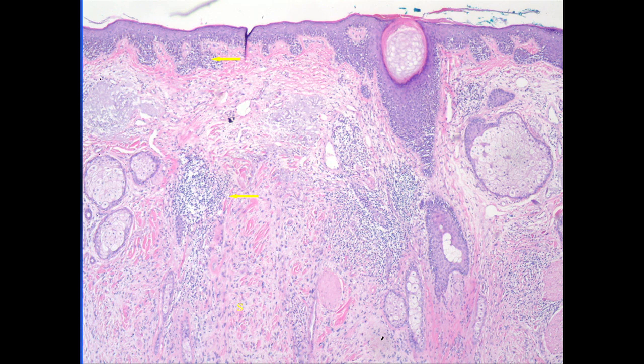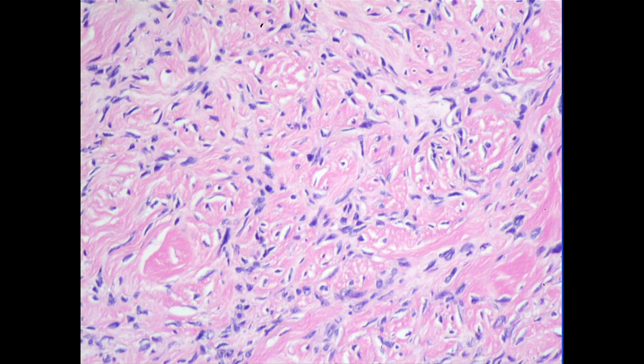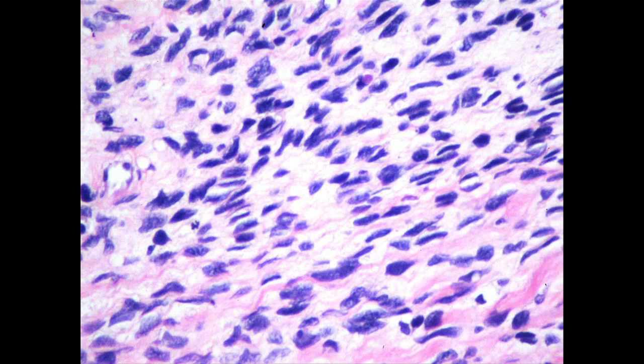This, and this. Okay, each one of those is important in establishing the diagnosis. In the dermis, there's this fascicular spindle cell proliferation. And within this one lesion, there are actually many different patterns. Here we see one area, and mind you, this is just one tumor. One area of the tumor looks like a dermatofibroma, cells interposed between collagen bundles.